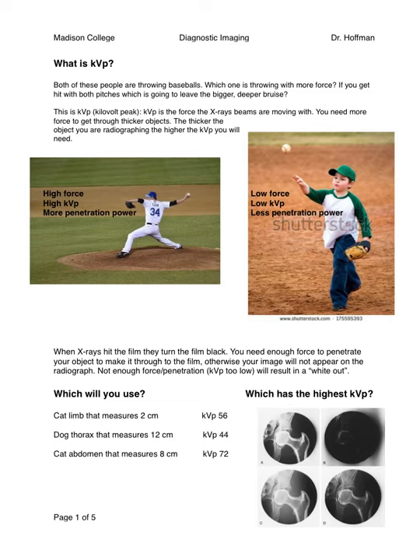And when we're using x-rays, we're going to be using the same type of concept. We're going to have to decide how much force we want the x-rays to come out of our machine with. It's going to be a key point to every x-ray you take. Did you use the right amount of force? If you just let it stay at the common sense point, things that are high force are going to have a lot of penetration power. Things that are low force are not going to have a lot of penetration power.